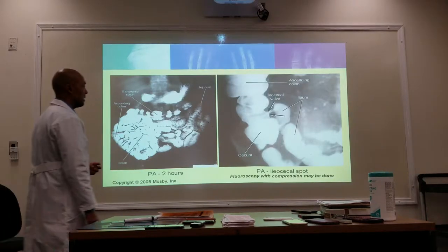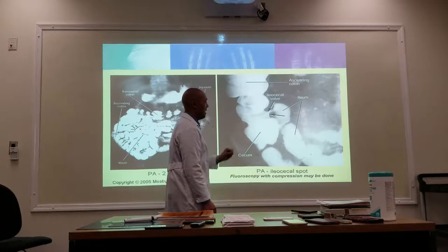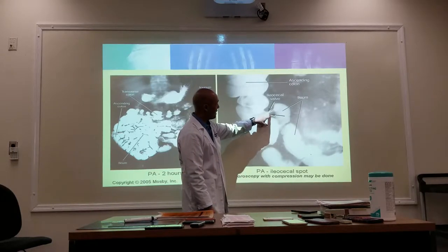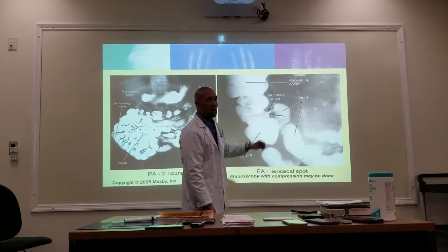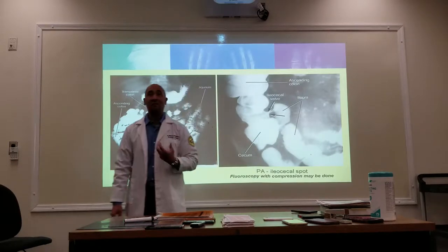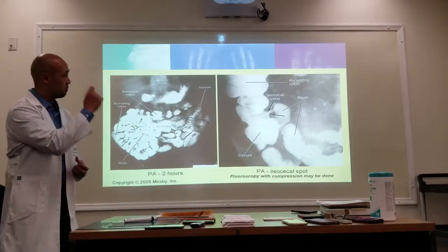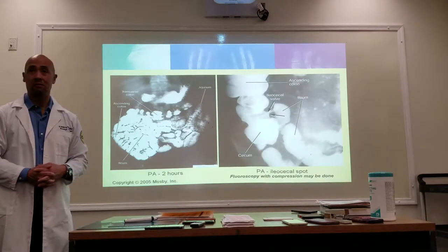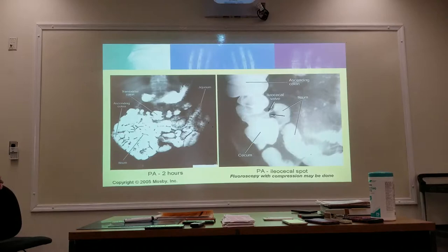Okay. And so here we have a spot image of the ileocecal valve. It's that tiny little piece right there that the doctors are looking for, that little segment right there. And once they're able to visually see that fluoroscopically, they take their spot film, their spot image, and we're done. That's it. Okay.